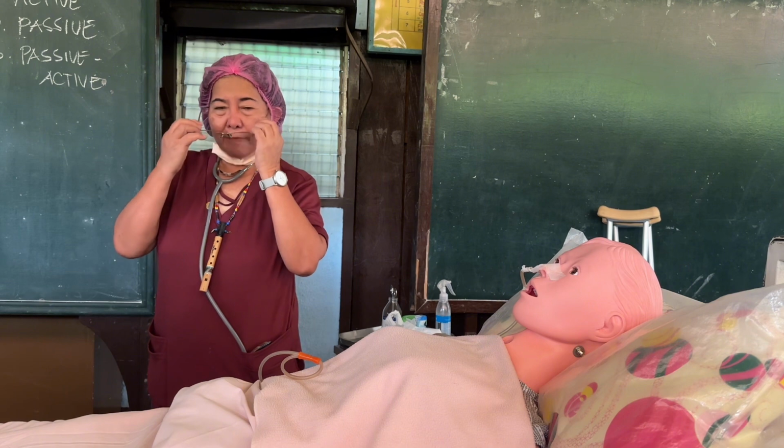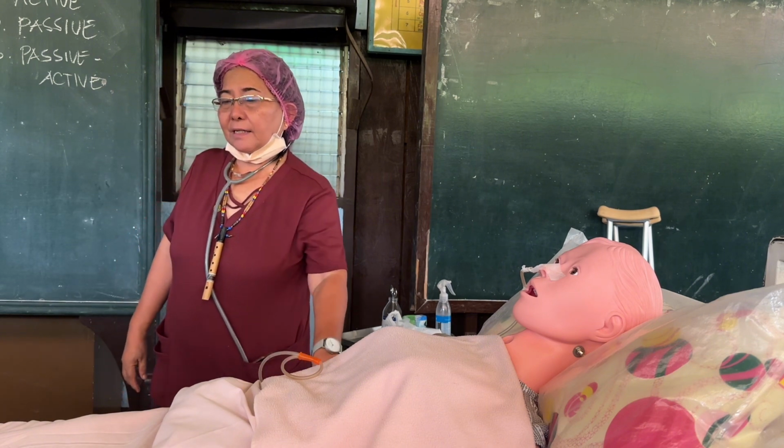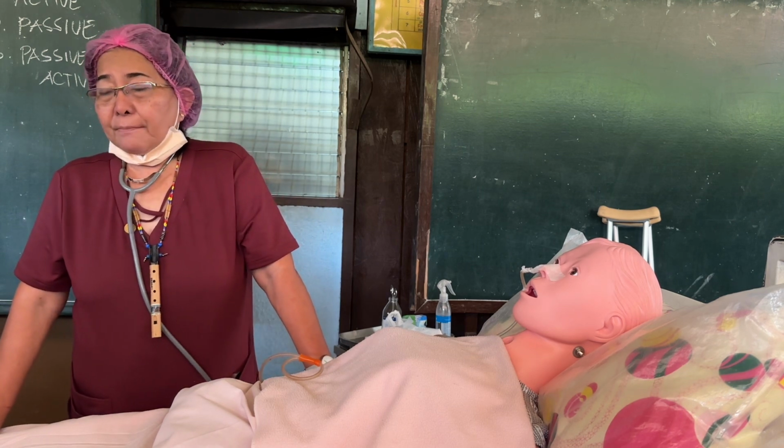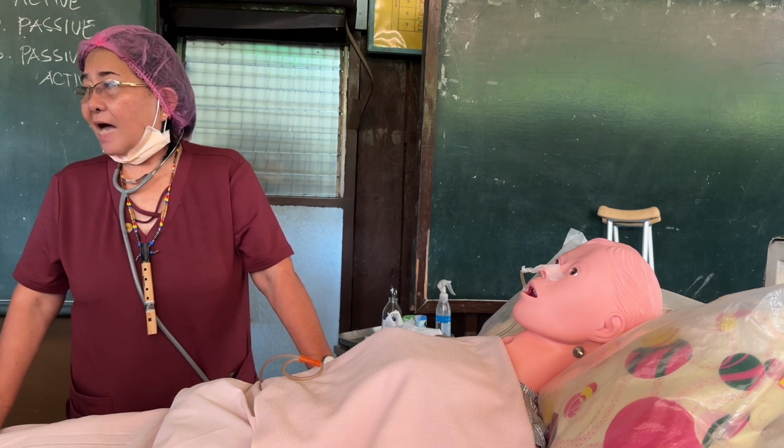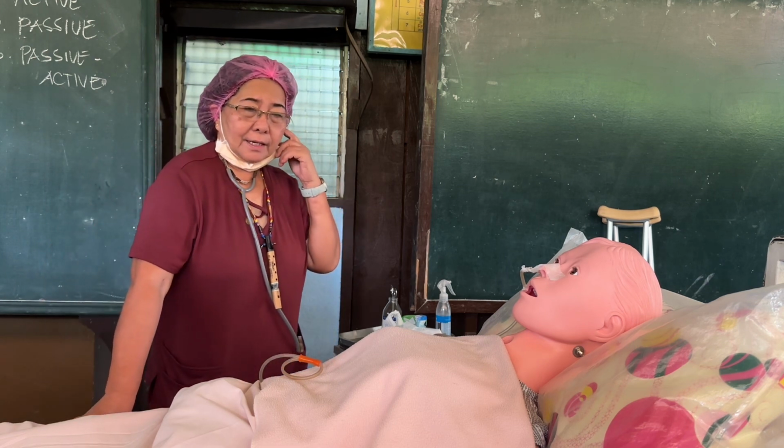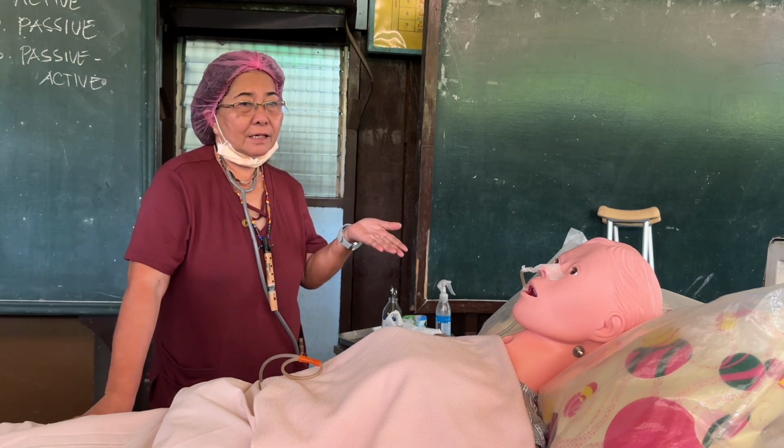Okay. So after how many days, or maybe two weeks, the doctor orders to remove the NGT. Remove NGT stat. What is stat, class? Stat, S-T-A-T, capital. Remove NGT stat. ASAP or now, immediately. PRN, as per needed, or if necessary.